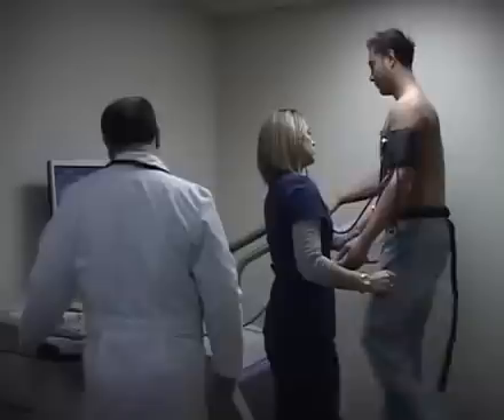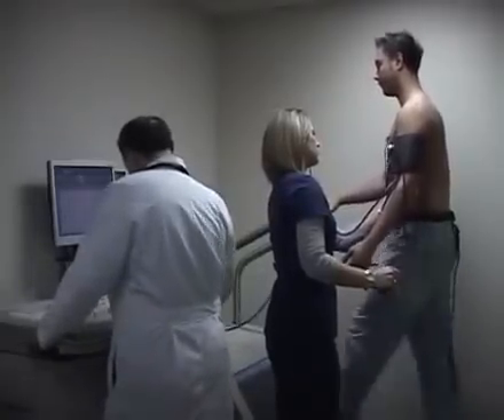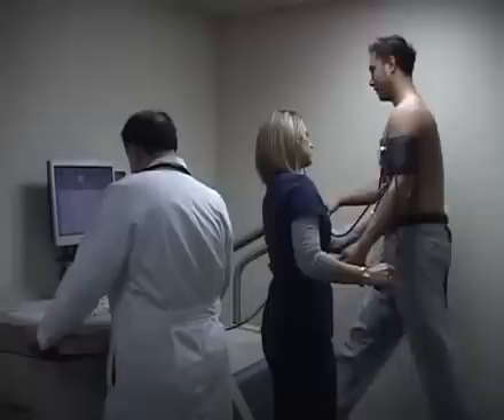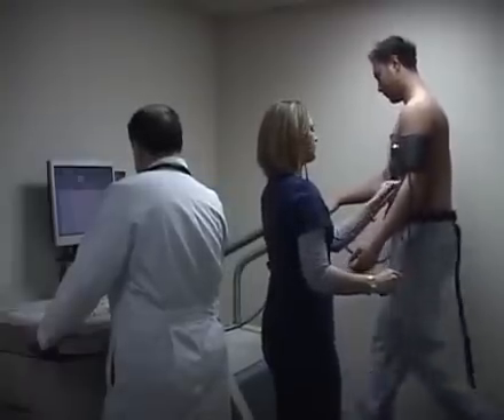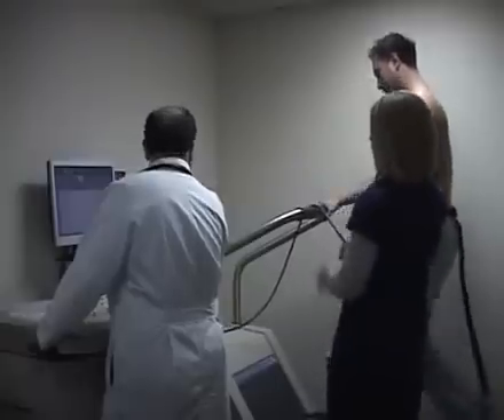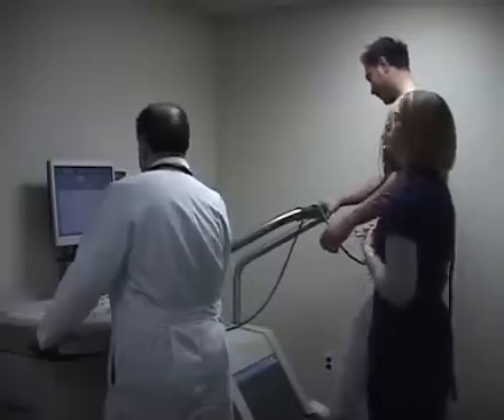Then we place 12 leads on the patient and ask the patient to stand on the treadmill and start exercising. We do the stress test based on the BRUCE protocol — a specific protocol where the treadmill goes faster and higher every three minutes.